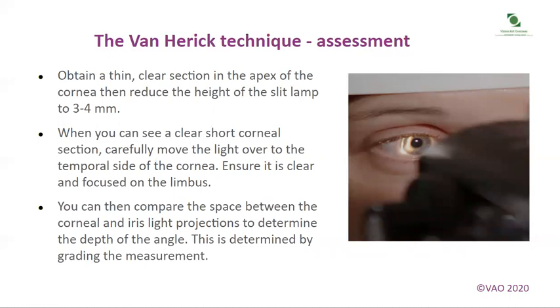For the Van Herrick technique assessment, obtain a thin, clear section in the apex of the cornea. Then reduce the height of the slit lamp to 3–4 mm. When you can see a clear, short corneal section, carefully move the light over to the temporal side of the cornea, ensuring it is clear and focused on the limbus. You can then compare the space between the corneal and iris light projections to determine the depth of the angle. This is determined by grading the measurement.